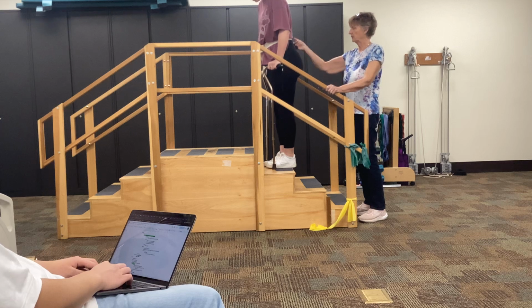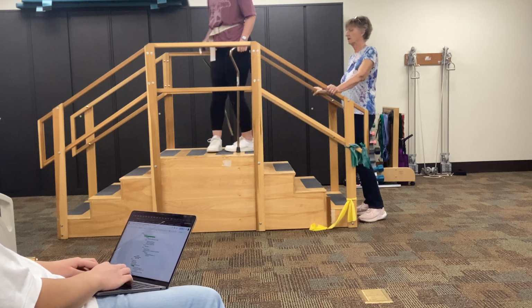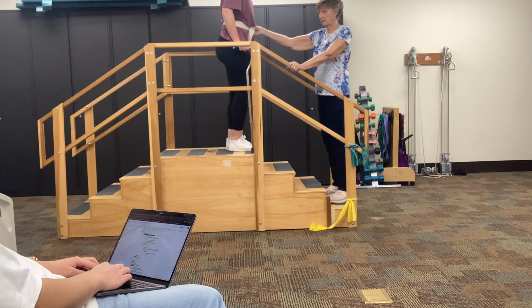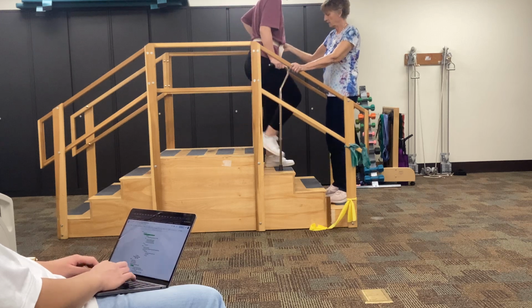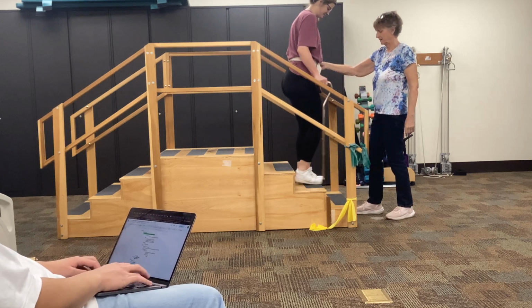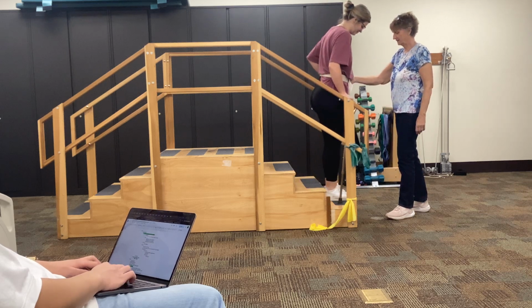Okay, so why don't you go on up to the top and turn, just go ahead, walk up to the top. All right, so come on down. Okay, so cane and the left. And then your right, cane on the left, up, cane on the left. Get that cane down there.